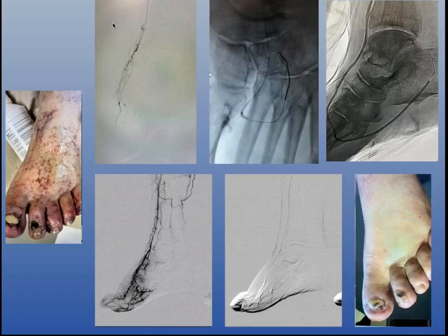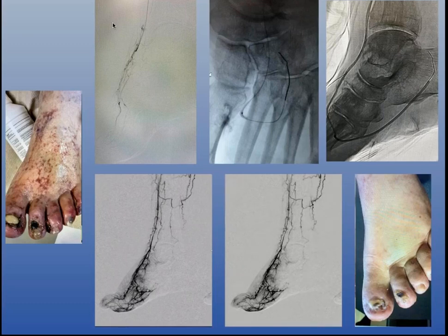And so what I'm going to show you with the first case is an example of a direct revascularization. Obviously, you've got a CLI patient who clearly has ischemic changes, areas of gangrene and small ulceration, has dependent rubor, etc., has a dorsalis pedis artery that's completely out.